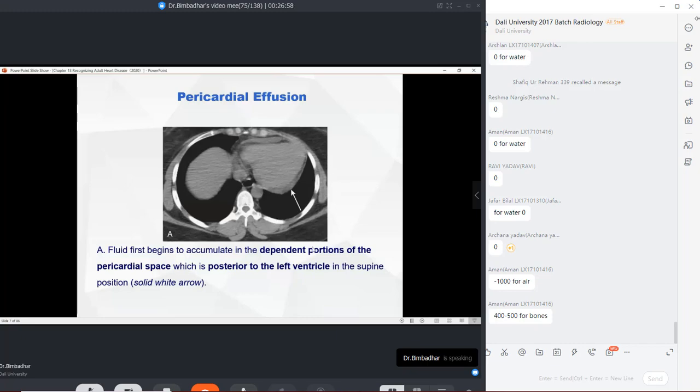Now, the second thing I'm going to do is look at this dependent area. This is the left side of the heart, and this is the left ventricle I am looking at. You see here, compared to the diameter along here, this diameter is a little bit higher. Compared to the length measured from this part to this part, this area has a higher diameter. So this became the most dependent part.